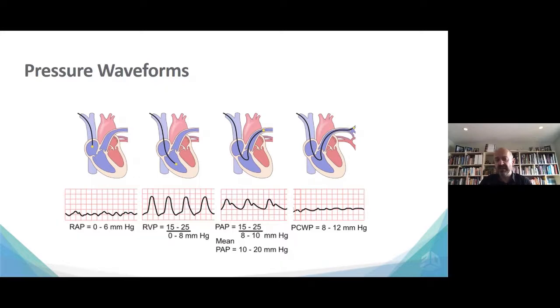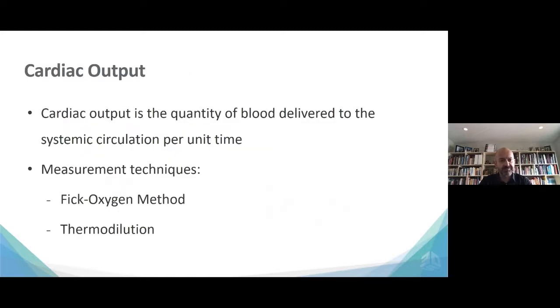This is really an estimate of the left atrial pressure. Again, it looks very similar to the RA pressure, the one you see on the left. But how you would know that you are in there is, first, your distance is further, and you've passed through these steps. You can't get to the tracing unless you had other previous steps. And then we'll see on the angiomentor how you can do a little tips and tricks to confirm that this is really what you need. So these are the pressure tracings.